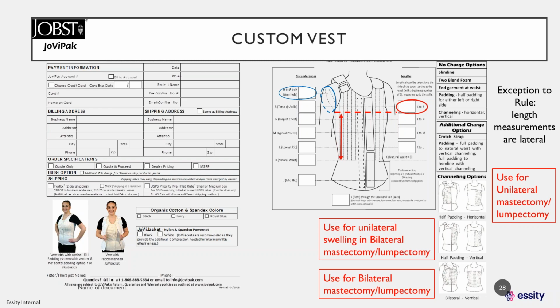Use the bilateral mastectomy channeling pattern for patients who have bilateral mastectomy or lumpectomy. When those lymph nodes have been removed and or radiated, that lymph needs to drain toward the inguinal lymph nodes. Therefore, we have vertical channeling.